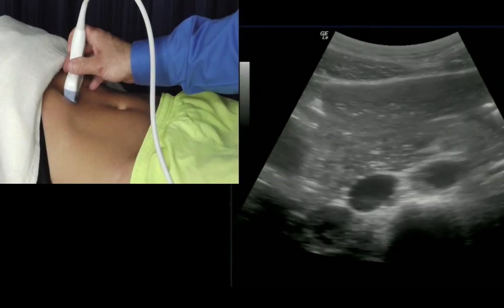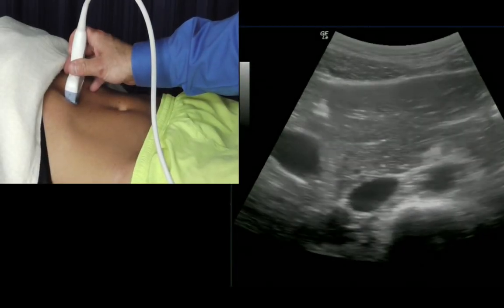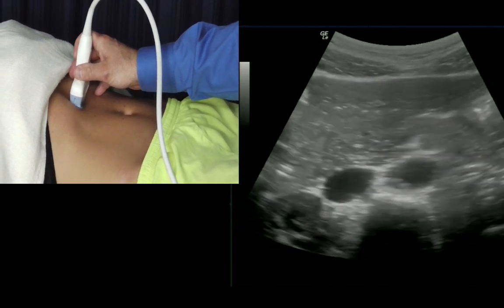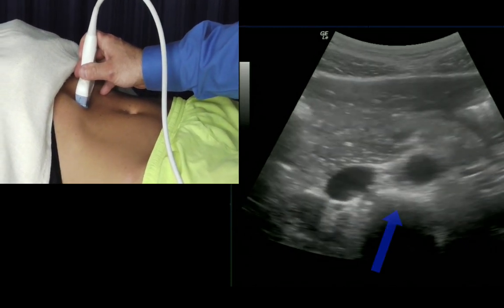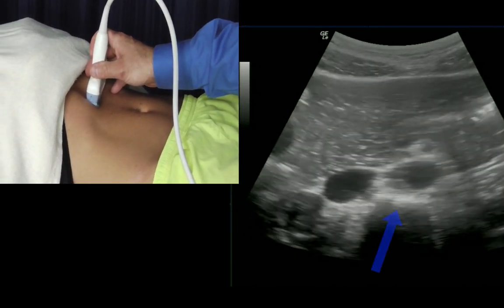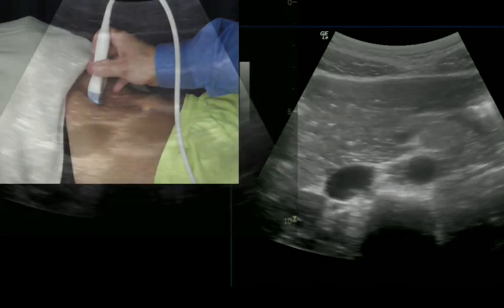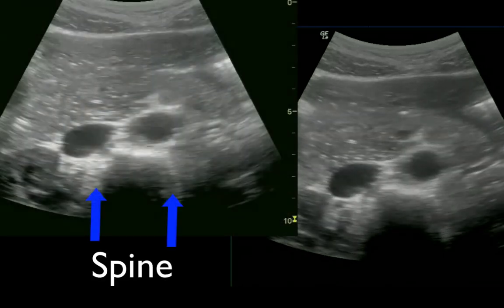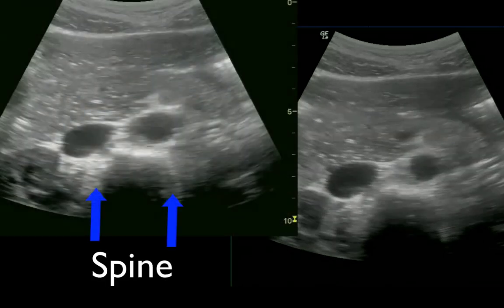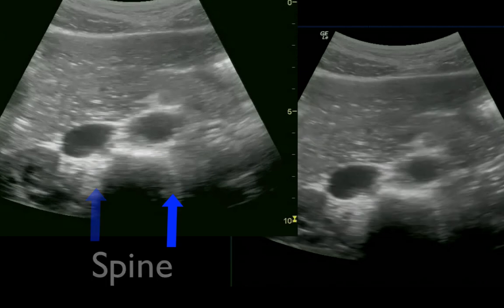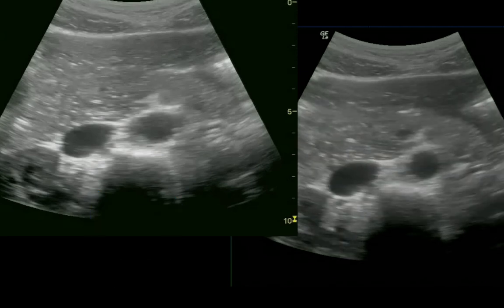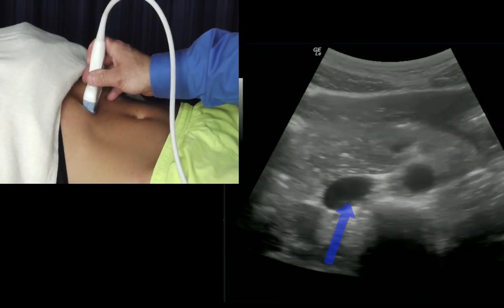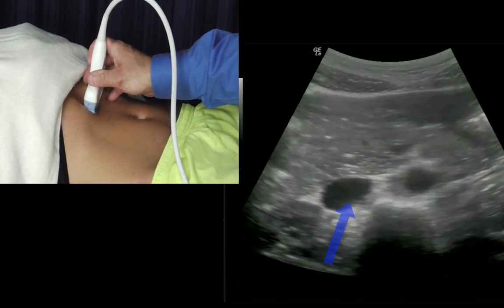As we place the probe on the abdomen, we can see several structures. When identifying the aorta, the first structure to find is the spine. The spine is hyperechoic with shadowing posterior and is deep on the screen. Once you identify the spine, you can look for the aorta and the IVC. Here we see the proximal aorta and the proximal IVC.